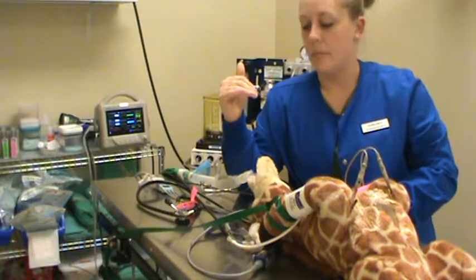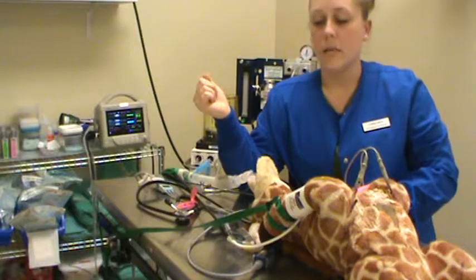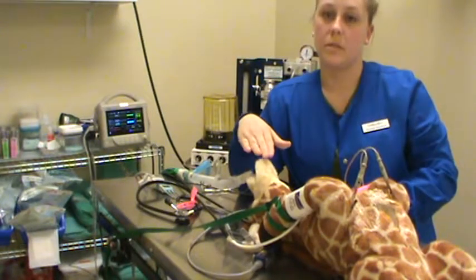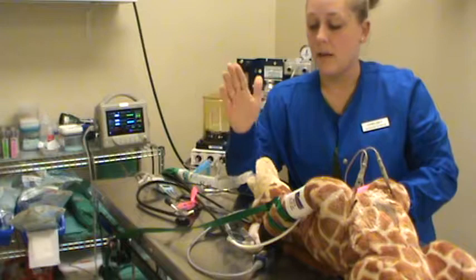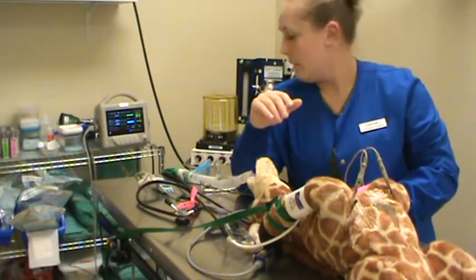Something has happened that's catastrophic, way too deep, way too long, and they've experienced anesthetic overdose and are heading towards anesthetic death. At this point, the doctor should already be aware of the problem. You shouldn't have to tell them at this stage in the game. They should already be hearing monitors going off, seeing people fluttering around.